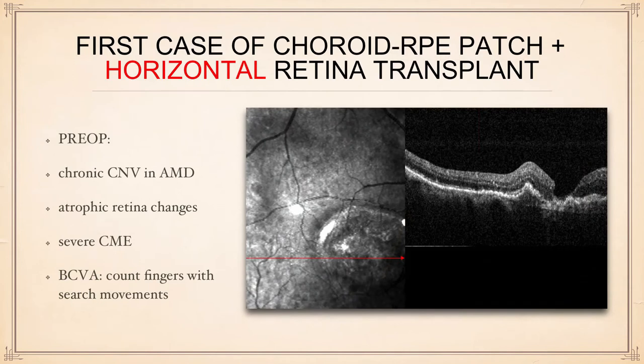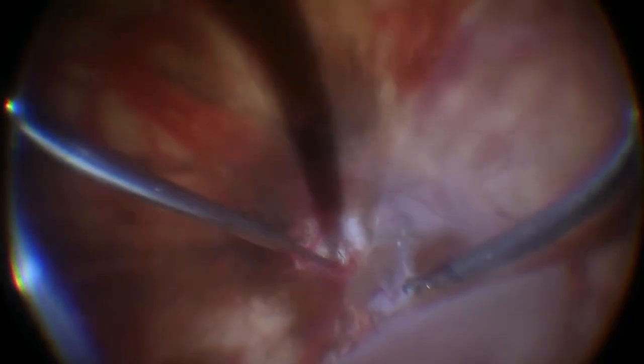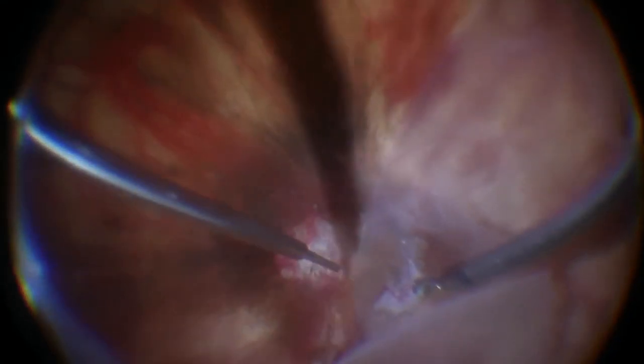Because formation of extrafoveal synapses is described, it might make sense. But in this case, as you may observe, I had a deep atrophy of the fovea on top of the CNV. So what happened during surgery? During surgery, when I detached the retina, as we usually do to perform subretinal surgery, I induced a macular hole.